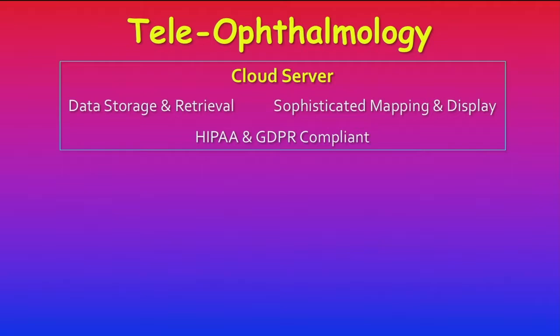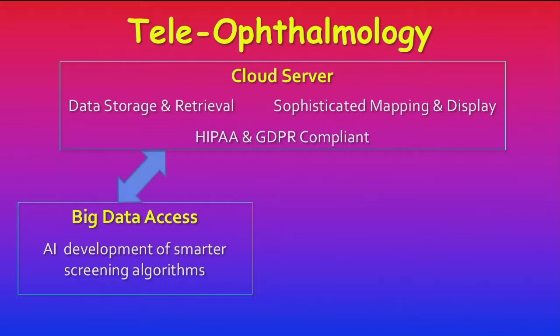Another major and great advantage of putting all of the data in the cloud is that multiple devices can be placed all over the world, and all of these can send their data to the cloud and form a large database of several hundred thousand exams that then can be used for big data analysis for the development, using artificial intelligence, of smarter screening algorithms. And I think this is very exciting.